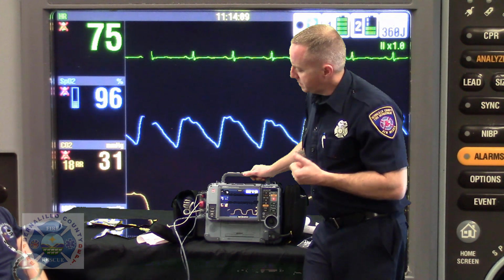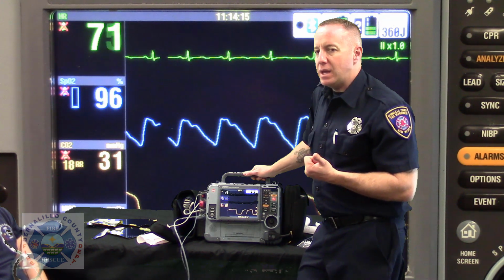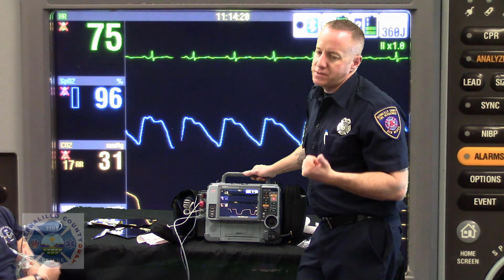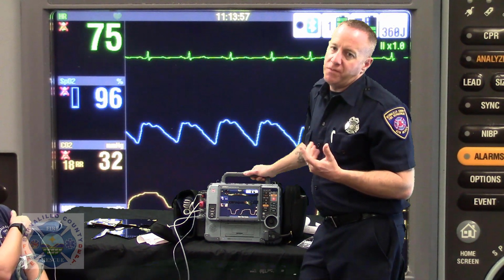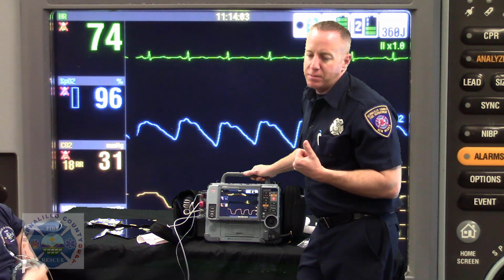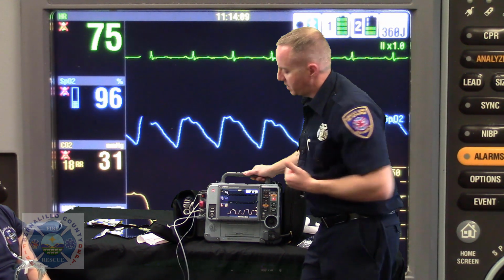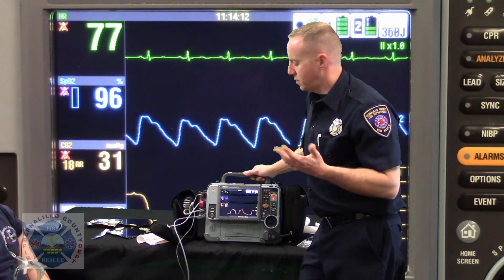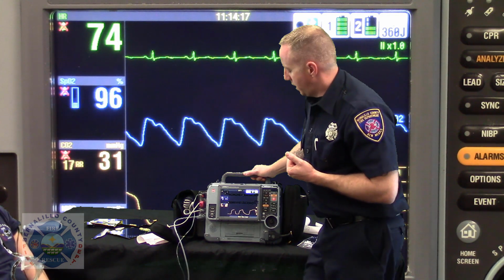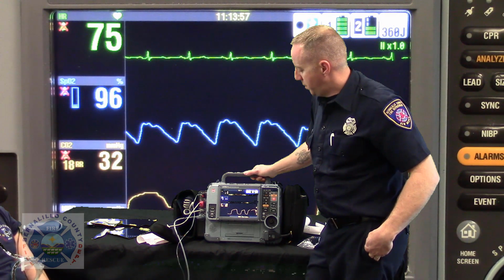Another case where you're going to want to use this, consider any, per protocol, if you're going to give any medication through an IV or an IM that has the ability to lower a patient's respiratory effort, for instance Versed or morphine or fentanyl, any kind of opioid, or ketamine. If you're giving a medication that could alter respiratory status, you're going to need to objectively monitor the patient's airway and breathing status. So just throw one of these devices in place and voila, the LifePak is monitoring it for you. The patient can move around as much as they want, and it's not going to change much here. You don't get artifact from patient movement.